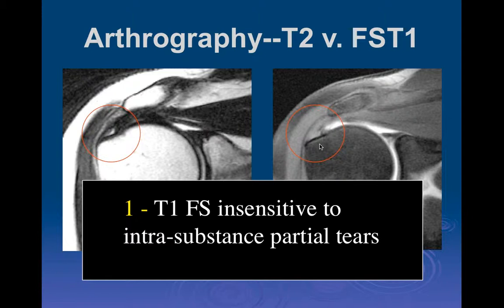So this is a partial interstitial tear at the foot plate, which are fairly common lesions, and they can be symptomatic. But if you don't have a fluid sensitive technique, you'll miss those, and maybe a cause of symptoms. Generally, if these don't communicate, most people I know will not operate on them. That doesn't mean everybody wouldn't operate, but this can explain the symptoms.